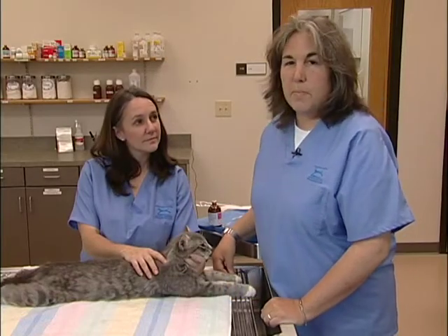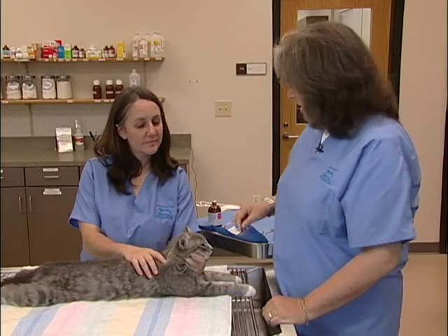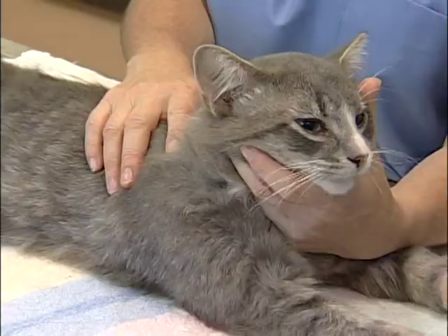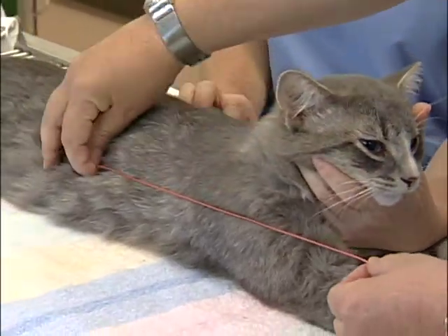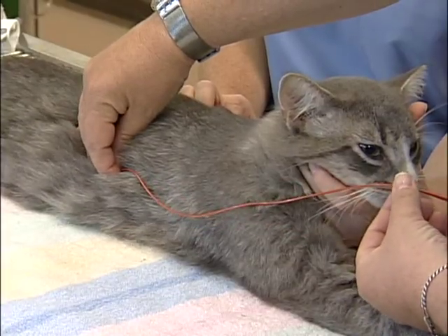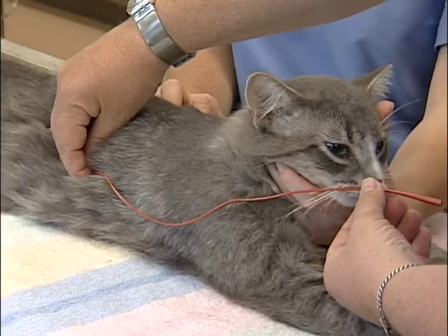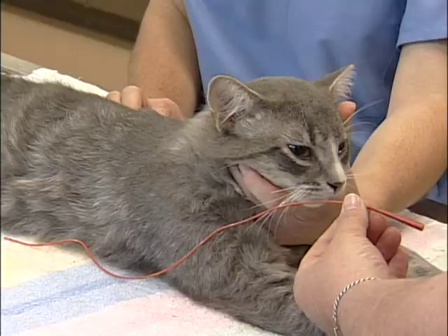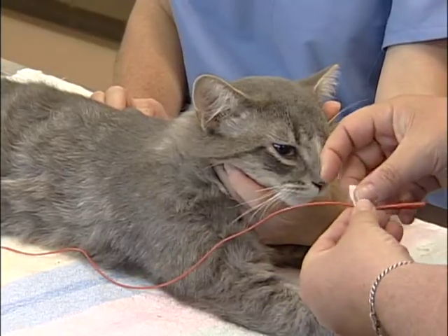In cats where we anticipate they will be unable or unwilling to eat for several days, we can place a nasogastric tube for feeding. I'm going to use a 5 French red rubber catheter in this cat, which I'll measure to the end of his ribcage. You can see that just about all of this tube will be passed into this cat with just this little bit extending beyond his nose.